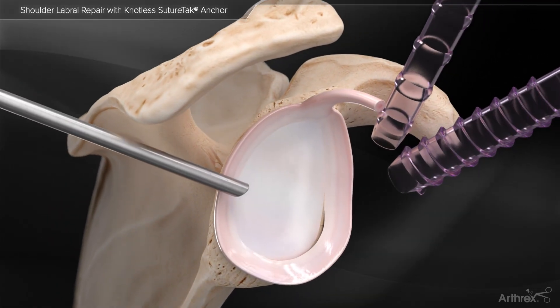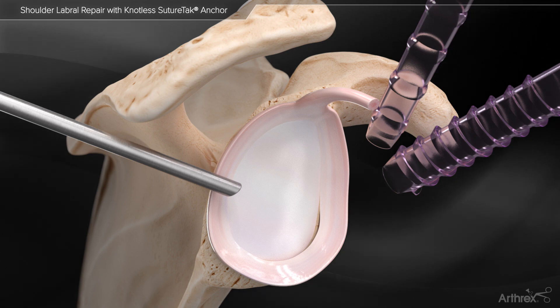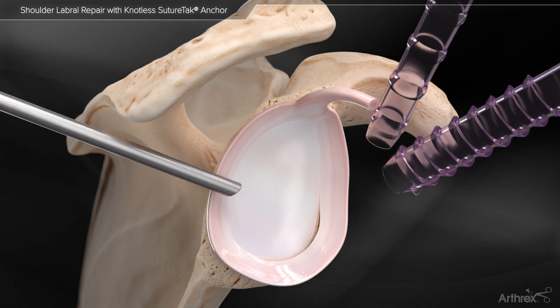The Arthrax knotless suture tack is a 3 mm suture anchor that can be inserted through a spear and allows the user the ability to control and tension the repair under direct visualization.